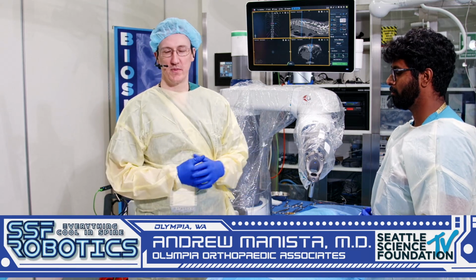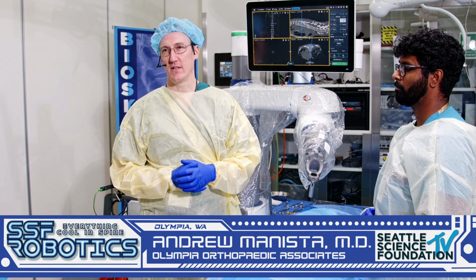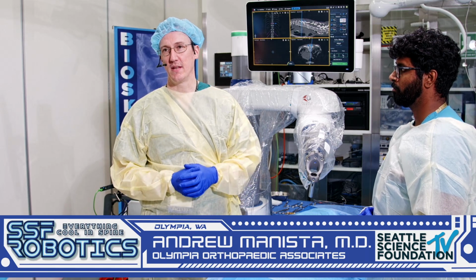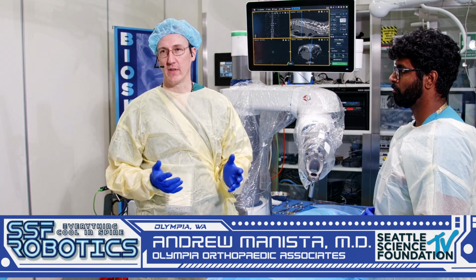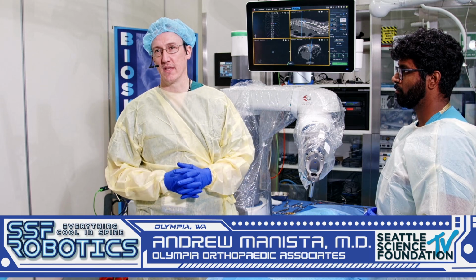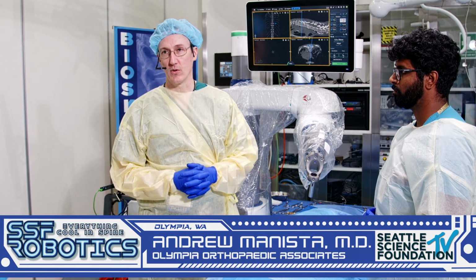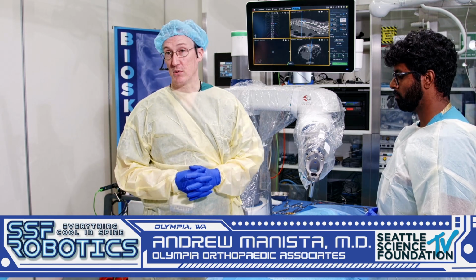We are going to pretend that this cadaveric specimen has a fracture and that we would be doing percutaneous fixation and internal bracing. This is actually a really great use of the robot that has been very practical in my practice. If a patient comes in with a burst fracture, neurologically intact but quite uncomfortable, this is a way we can minimize the disruption to them, place hardware, let them heal, and then even electively remove it. And this has proved to be a great way to save some motion rather than having to fuse these patients. So I've been pretty pleased with it.